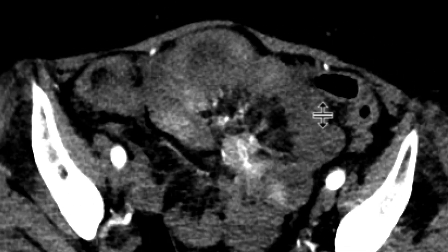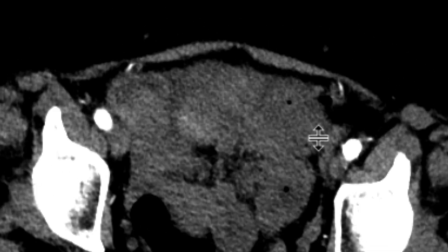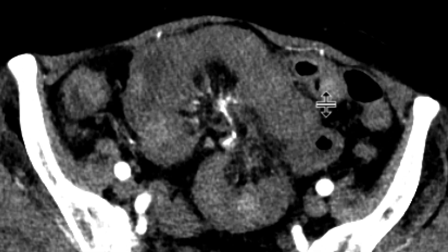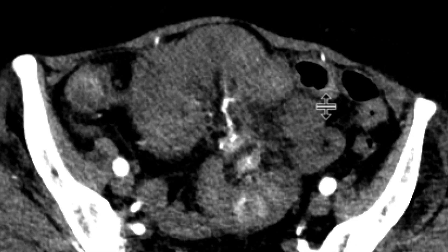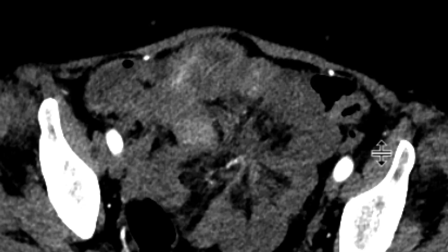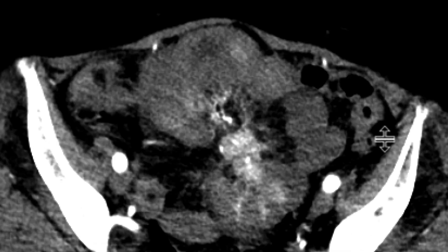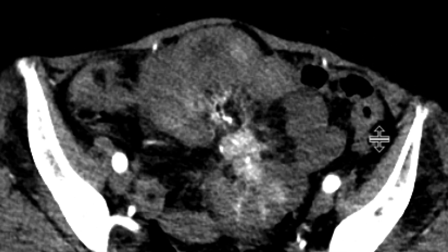These findings are classic for a carcinoid tumor of the small bowel. Usually they're multifocal and can be seen in several locations adjacent to one another. They're often difficult to see, but with close inspection and the right contrast timing, they can come out and be appreciated, as in this instance.